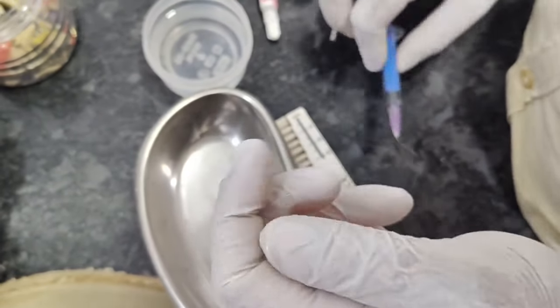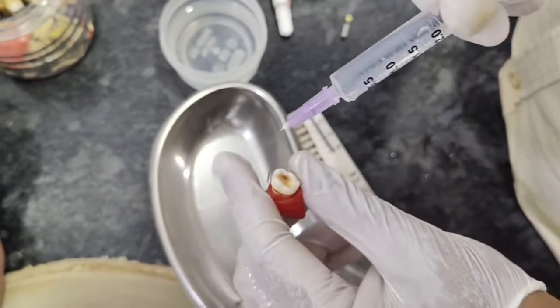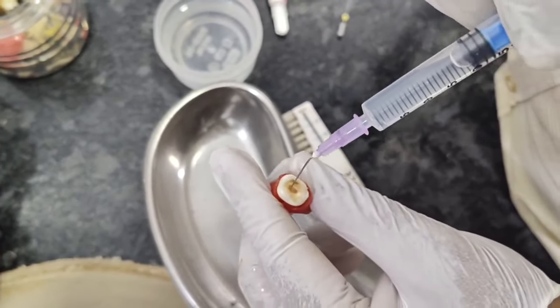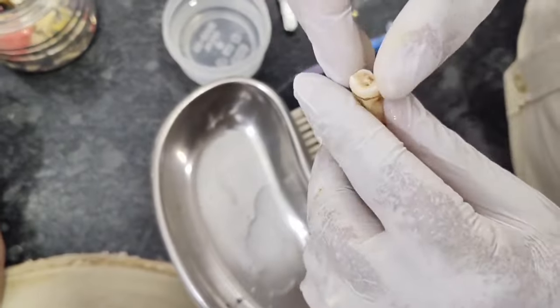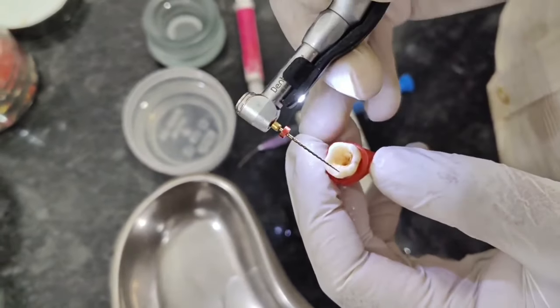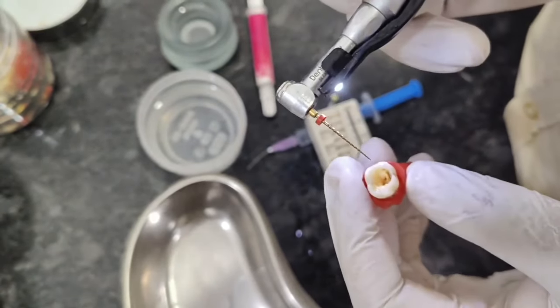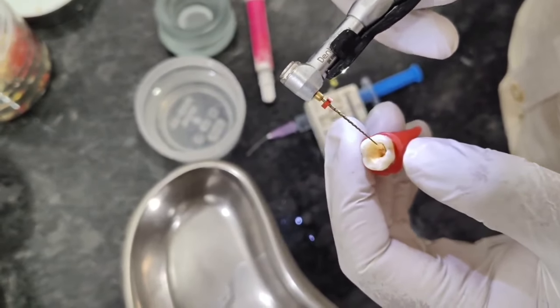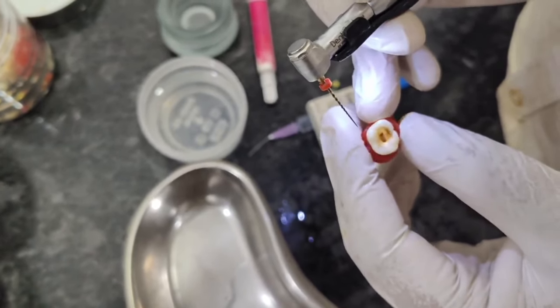So now we will irrigate it. You should use a lot of sodium hypochlorite while irrigating. So now this is the 4% 25 file. This is red in color. We have taken the working length as 18 mm. It's not always necessary to go till 4% 25. If the canal is wide, you have to extend it till 6% 20, or you can just keep it to 4% 25. In this case, I am only taking till 4% 25. You can see the canals, they have widened so nicely.